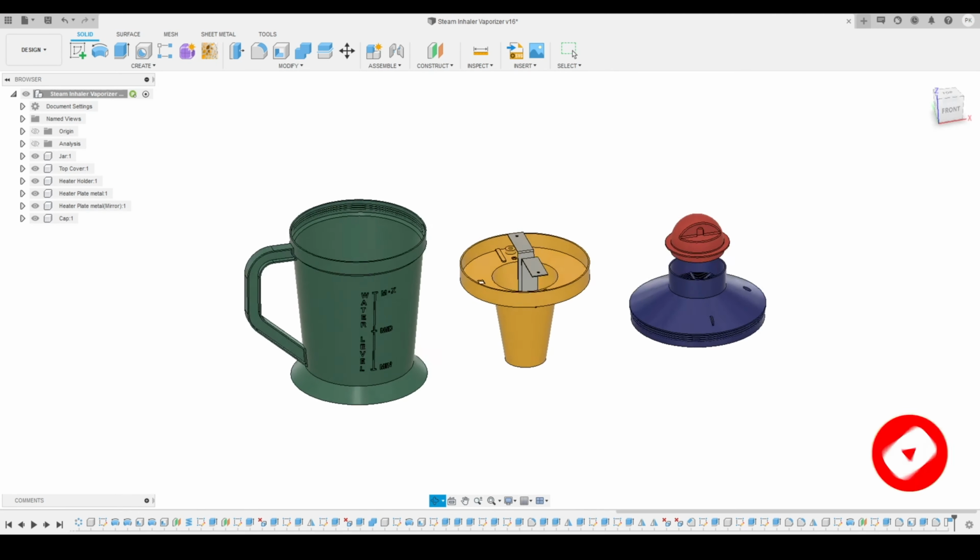So that's why I defined this 10 millimeters. So this way you can start defining your sketches. Just select the lines, select the points up to which you want to define, and you can just drag outside and you will be able to provide your distance. Here you can see I'm just selecting the point and the line or the entities, and I'm able to give the dimensions whatever I want.